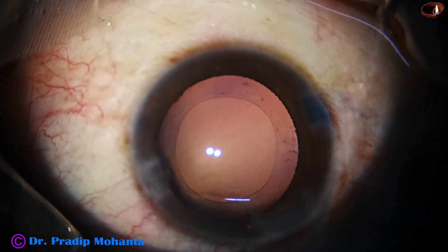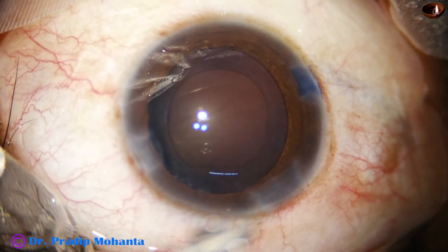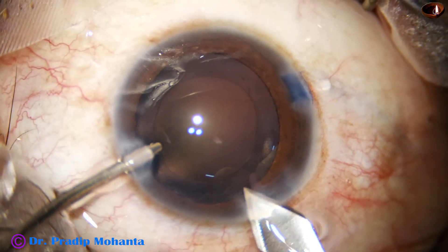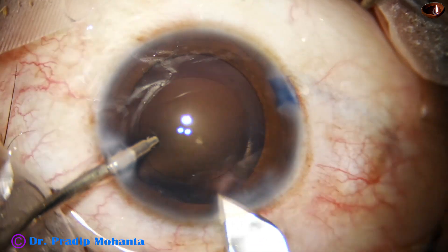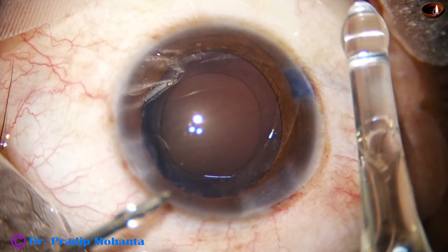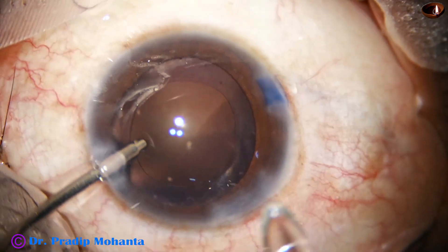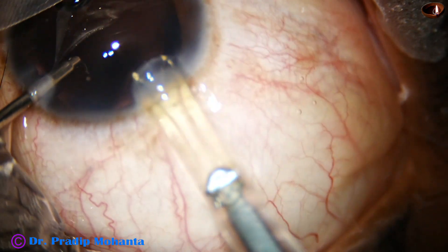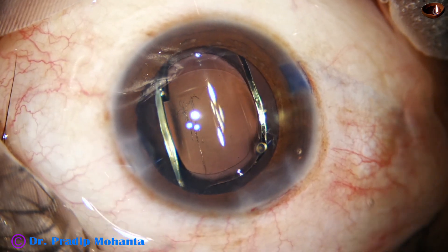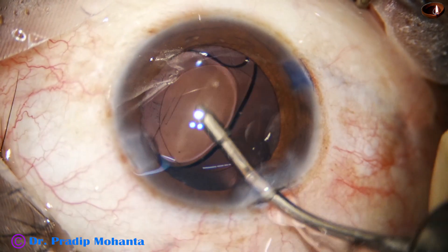Now I am enlarging the main wound — it is better to enlarge the wound in some cases, particularly when using a B cartridge. With just one cut the main wound is enlarged from 2.8 to about 3 millimeters. This is a B cartridge; the cartridge gets nicely engaged if we enlarge the main wound, otherwise the lens can get stuck at the wound after only one-third of injection, stressing the wound too much. Now the irrigating probe goes behind the lens.